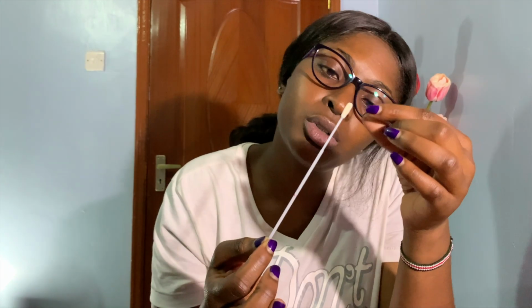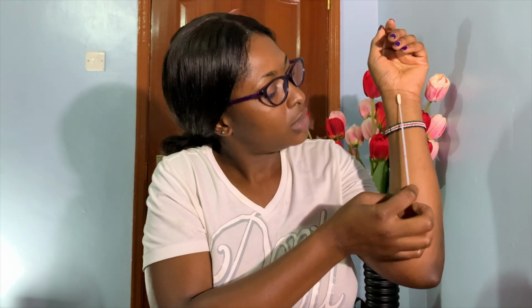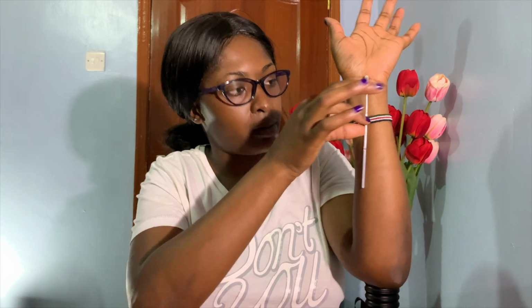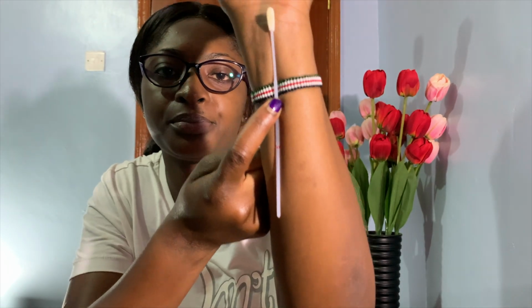This part is just soft, like a little tiny sponge, and it has demarcations. So let's see how long this thing is if I measure it on my arm. So yeah, that is about how long it is.